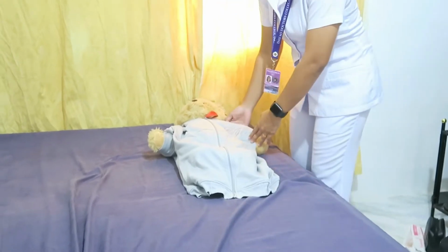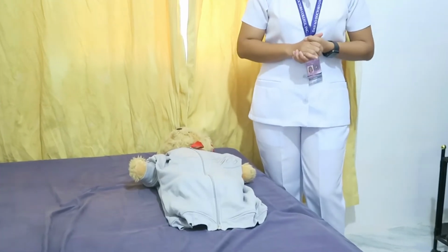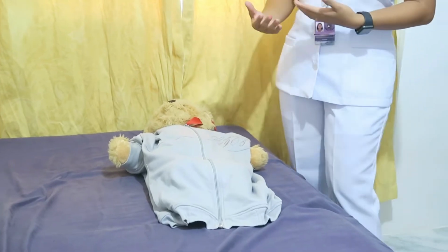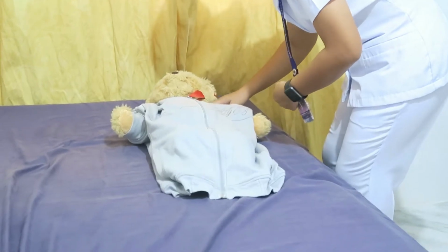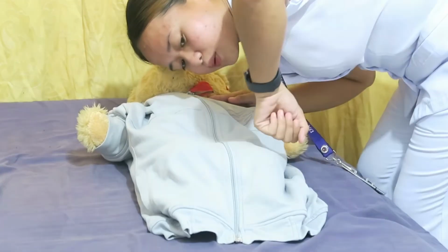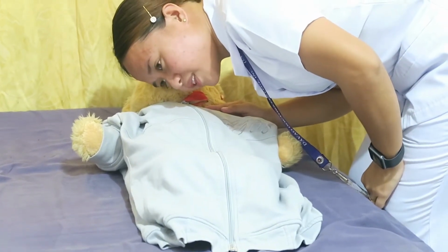Help! Someone help! Next is to check pulse and breathing simultaneously, for not more than 10 seconds, and check the carotid pulse to see if chest compression and the defibrillator are needed. So, let's check the pulse and the breathing of our patient. Checking of the pulse, breathing. 1001, 1002, 1003, 1004, 1005, 1006, 1007, 1008, 1009, 1010.